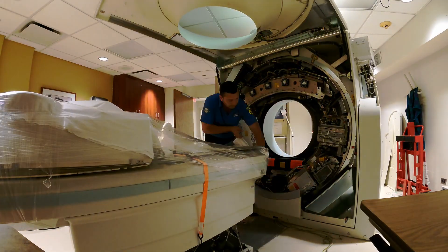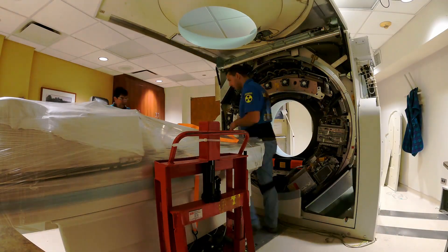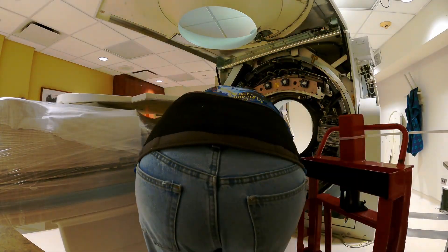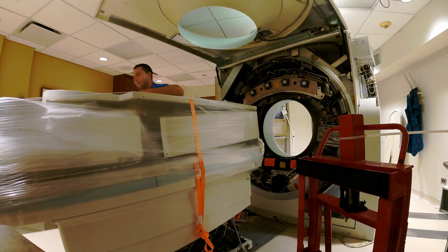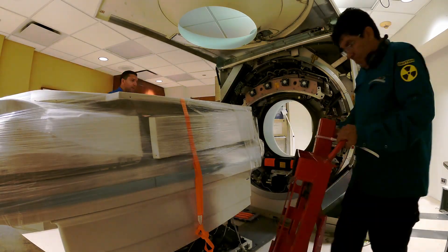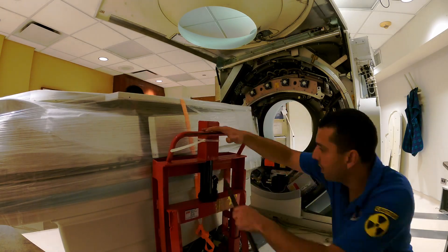The Siemens Sensation 64 was the first CT scanner with the ability to take 192 images of the heart per second. The Z-UHR option on the Siemens Sensation 64 offers an exceptional 0.24mm isotropic resolution, allowing it to clearly visualize the complex inner ear bones and joints.